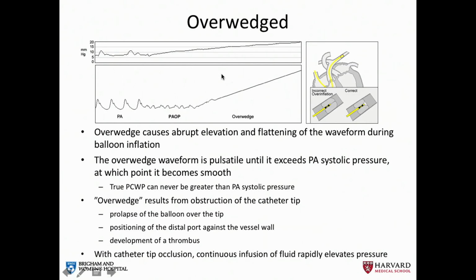But sometimes people don't recognize that and end up measuring a higher than normal wedge. And that's why I say it's really important that you look at the waveform, think about where it is relative to the EKG, as well as in the context of the physiology.